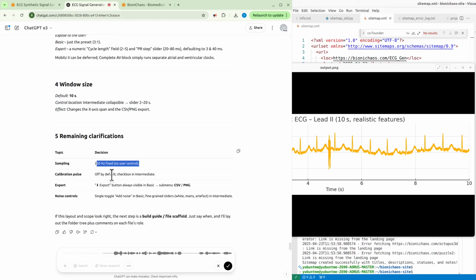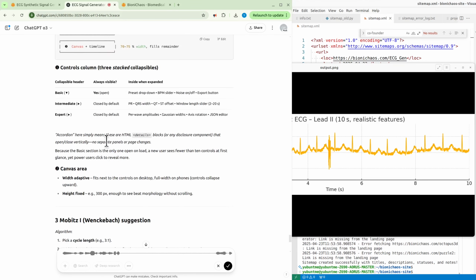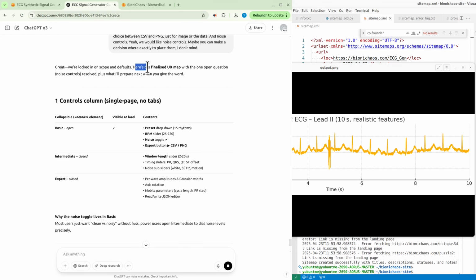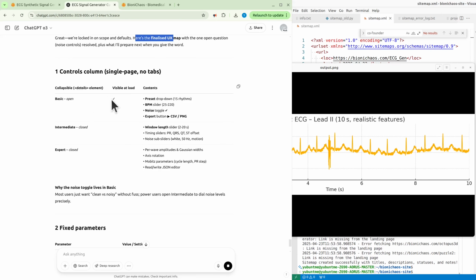Calibration pulse. Yeah, we don't need it. So I don't think we need a checkbox for it at all anywhere. Export button, yes, with a choice between CSV and PNG, just for the image or the data. And noise controls, yes, we would like noise controls. Maybe you can make a decision where exactly to place them. I don't mind. Okay, so we have a finalized UX map.